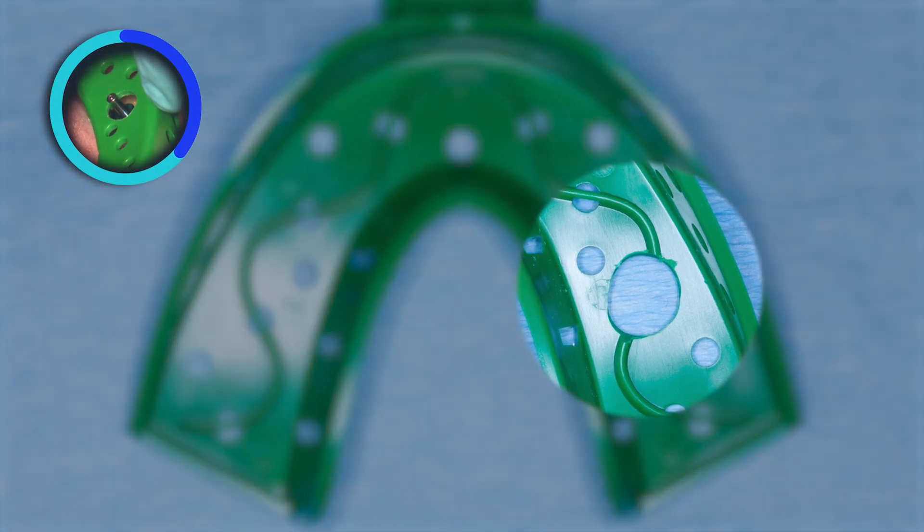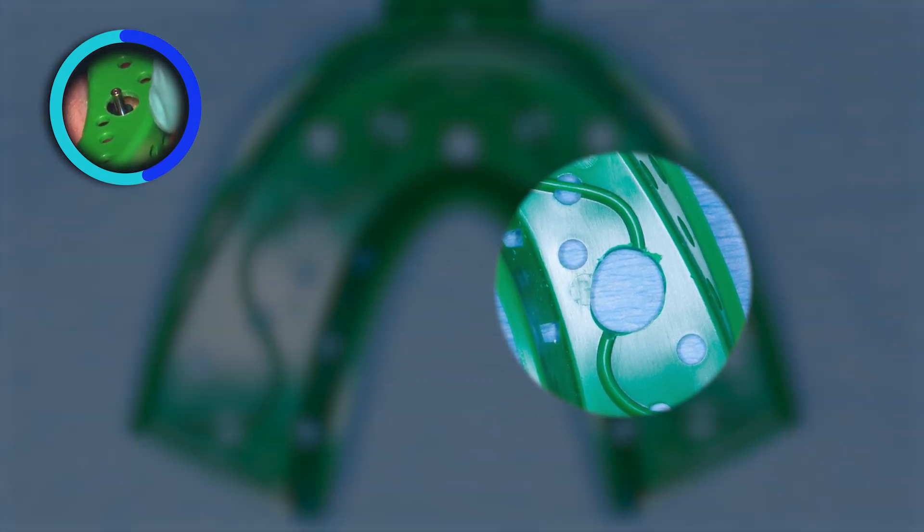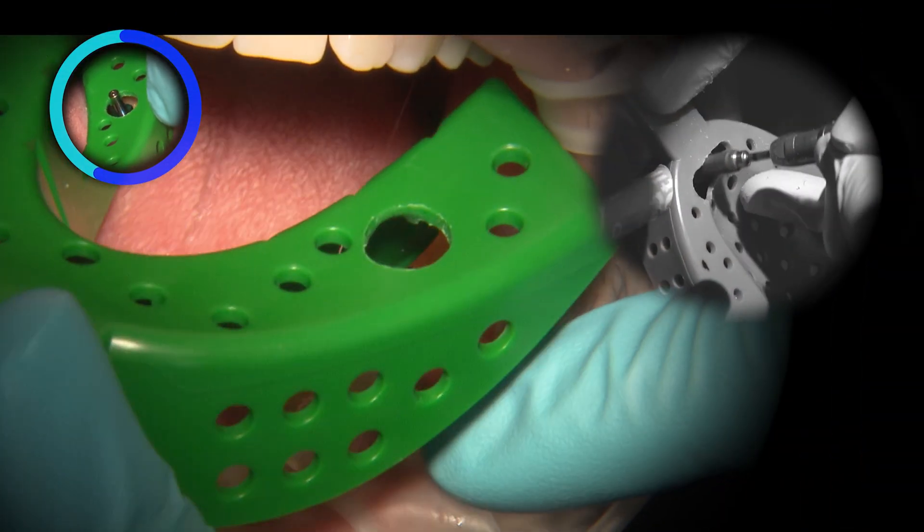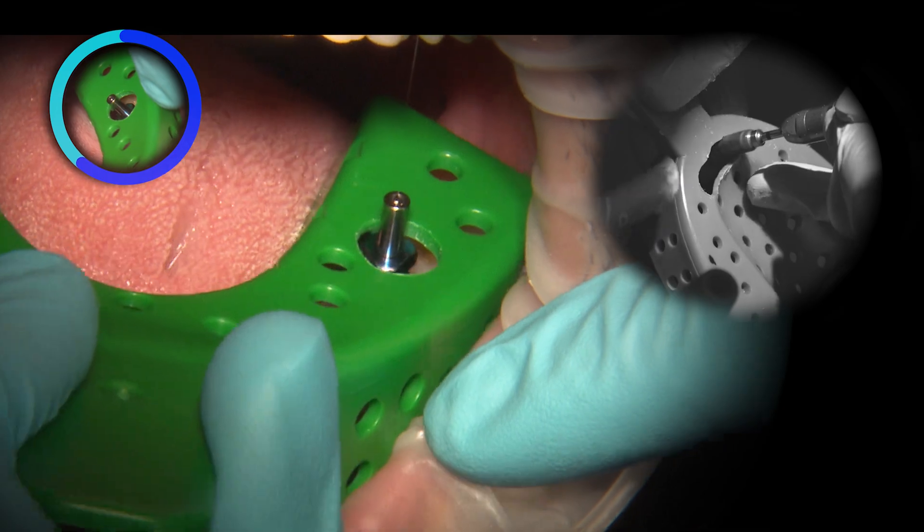In an open tray technique, the tray is first verified for fit and to identify the location of the impression coping. The tray will have to be adjusted to allow the top of the impression coping to pop through. An acrylic burr is utilized to create a perforation in the tray.